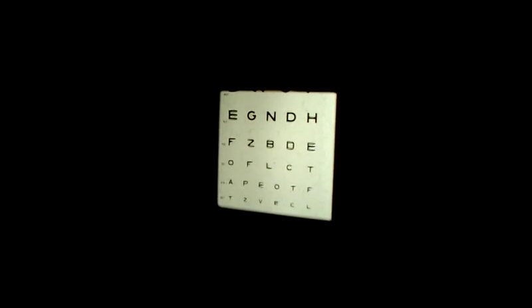We're going to check the vision of a patient post Alcon ReSTOR surgery. Here's an eye chart and here's my patient in a regular ophthalmology lane. Can you read the top line there?